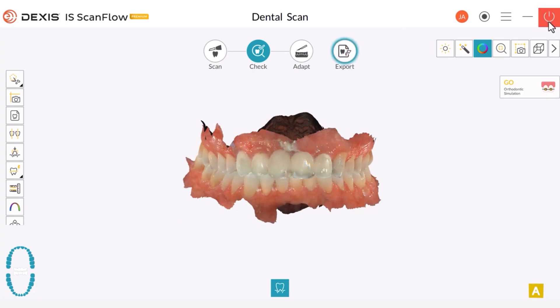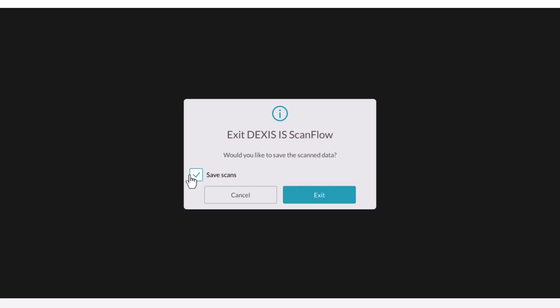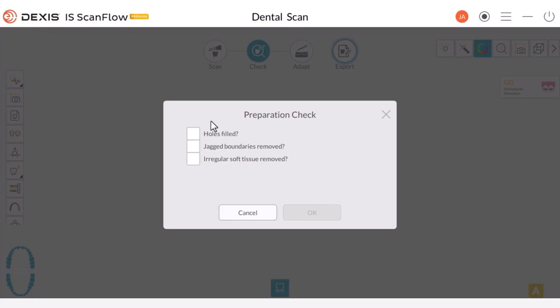If you select the Close button, remember to mark the checkbox to confirm your intention to save the scan and then choose Exit. In the next window, you will be presented with the Preparation Check, which prompts you to verify that all data has been reviewed, ensuring that there are no holes, and that the scan includes all the required areas, margins, and soft tissue. The Preparation Check is an optional step and can be enabled in Preferences. Finally, click OK and the software initiates the process of saving the scan and closing the software.